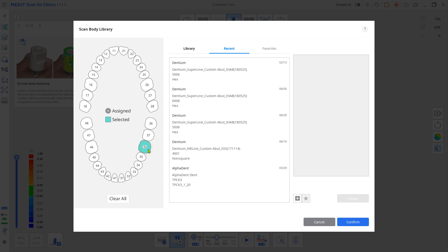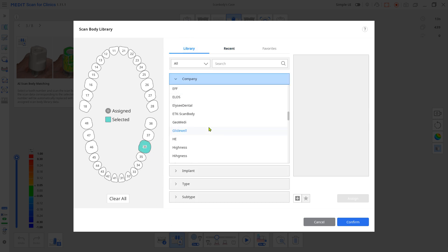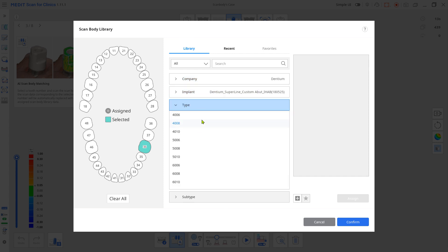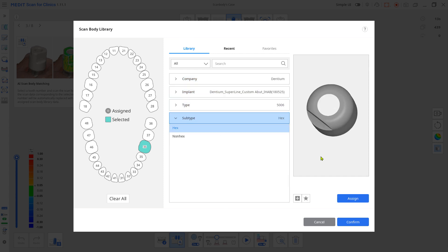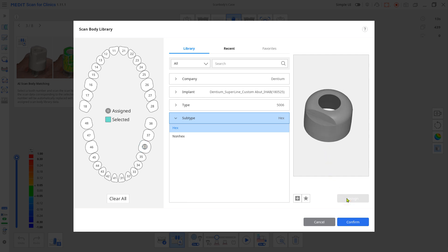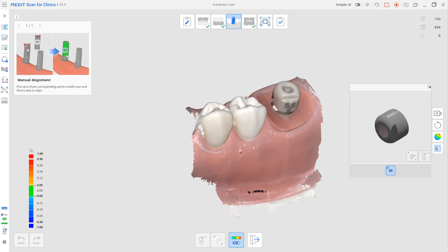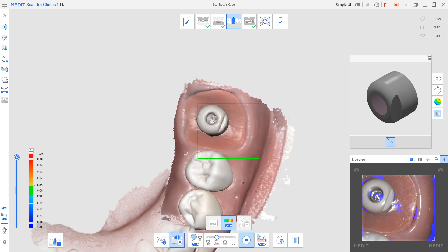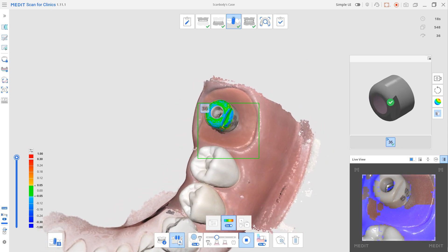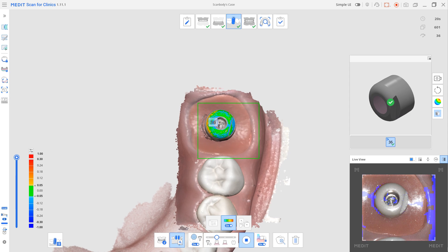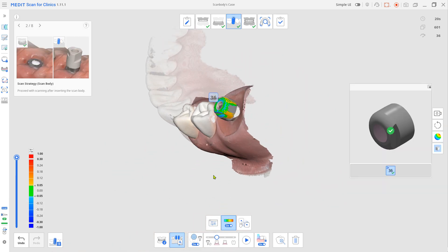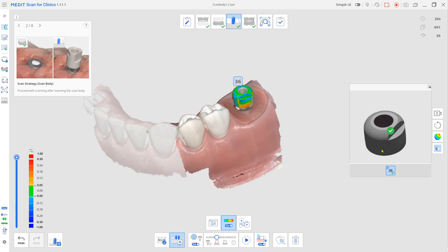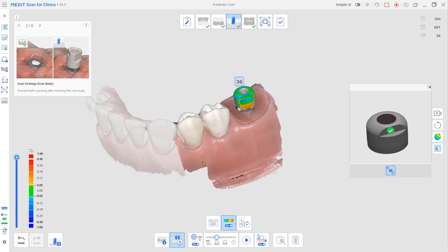Choose the teeth and your product from the library. Click Assign. Now scan over the same scan body area starting from the adjacent teeth. And in just a few seconds, the system automatically aligns and overlaps the CAD constructed scan body to your actual scanned one.